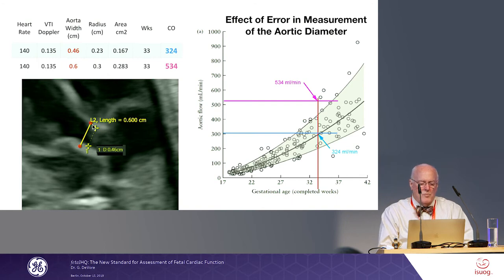So the problem with a Doppler approach is you have to be very, very precise on where you place your measurement for the diameter, because in the equation, it really grossly affects it. That's why we don't prefer that.